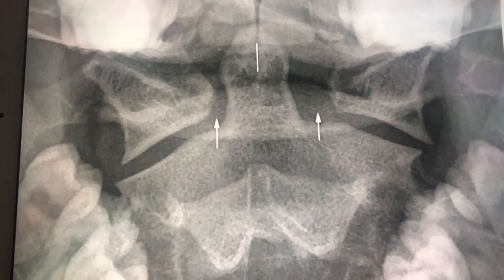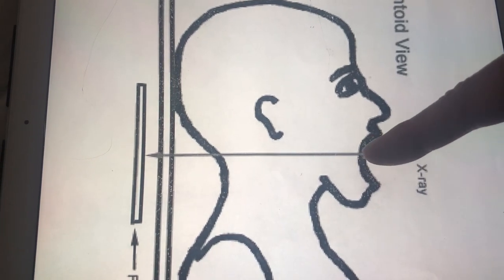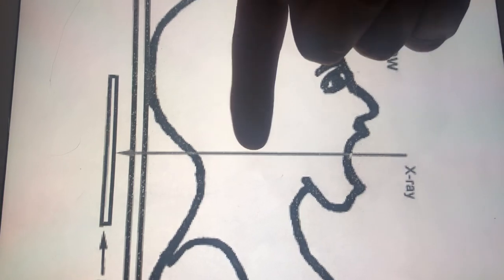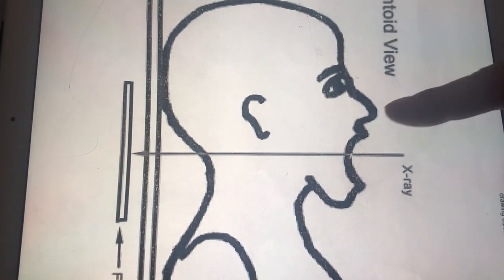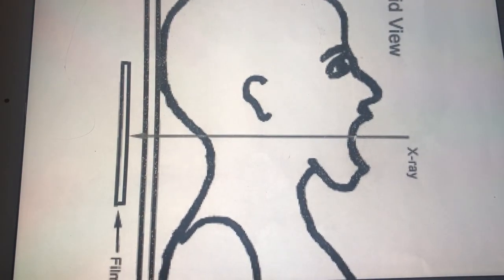So how do they tell you how to do this? They tell you by putting the central ray at the bottom of the top of the teeth, and it has to go through the mastoid tip, which is underneath the ear. Then you bring it down to the apex — the crease — shoot this way and you should get a great picture.